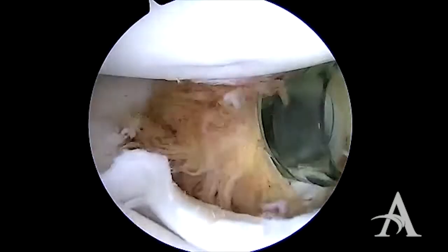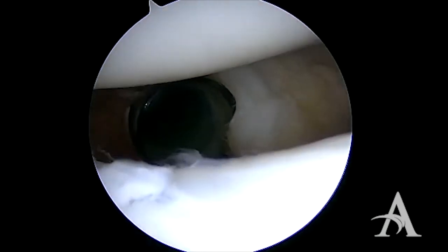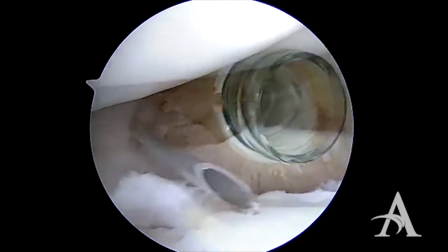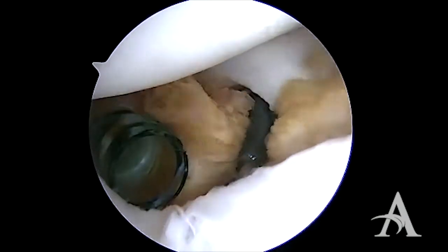Next we will establish an anterior inferior corkscrew cannula just above the subscapularis tendon. A second cannula is placed just below the biceps. This gives us two working cannulas in the rotator interval.